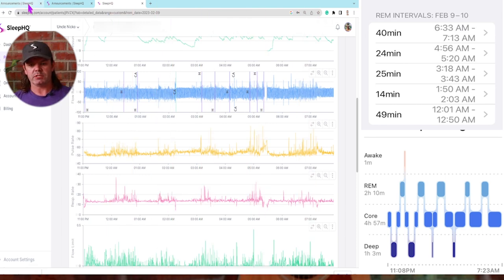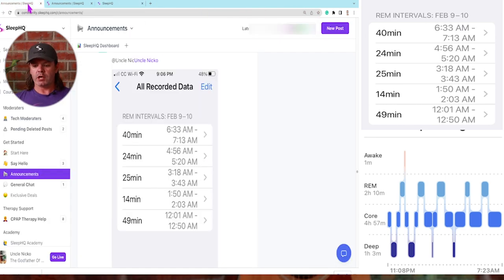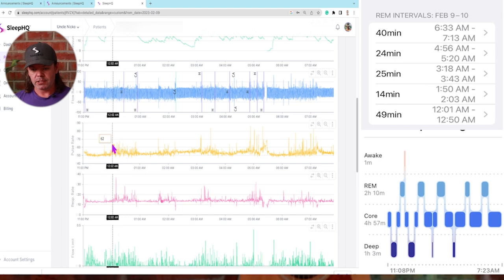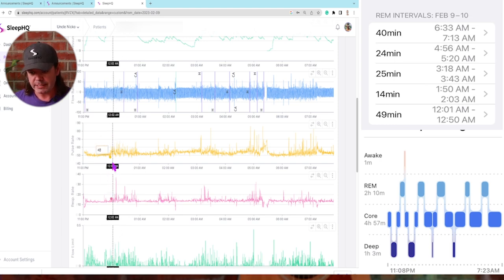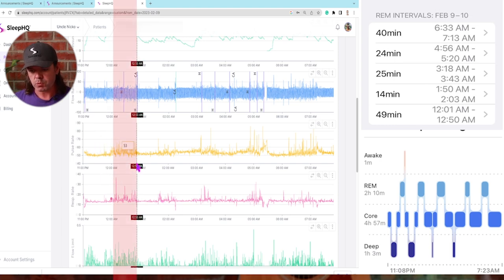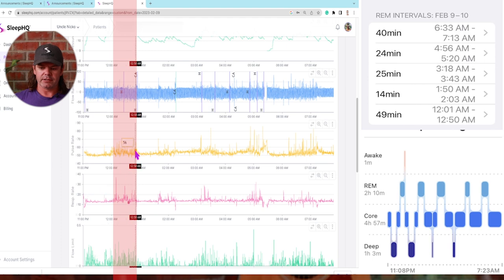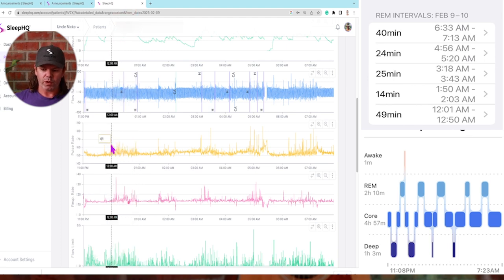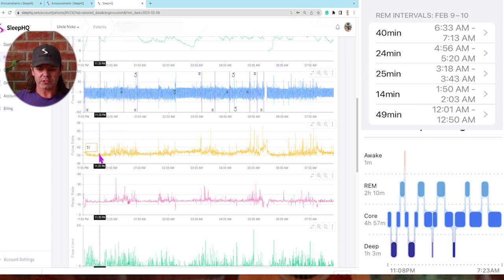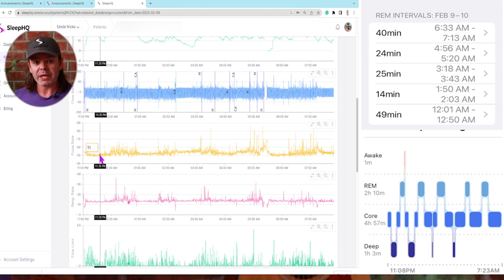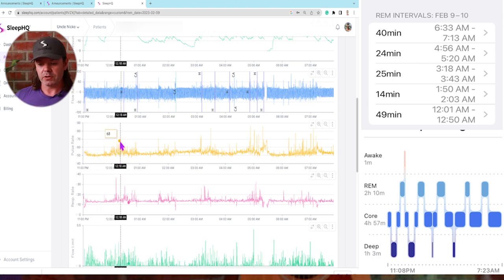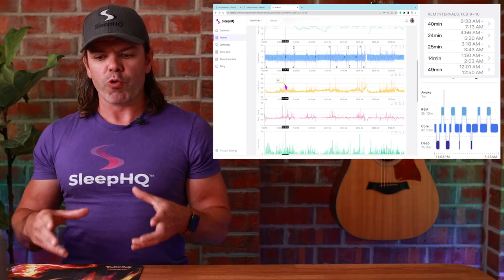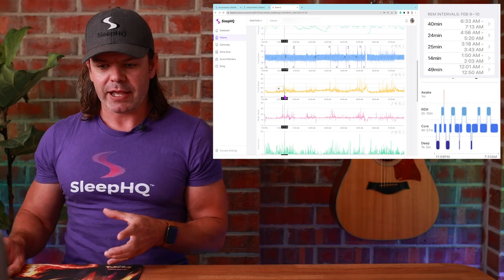So the first timestamp was 12:01 to 12:50. Let's check it out. 12:01 right here to 12:50. Take a look at that. Have a look what happens. All of a sudden, his heart's gone from 51 beats per minute, and all of a sudden, look at it now, 68 beats per minute. Erratic, irregular. Look at it spiking, and that's matching up with the respiratory rate.